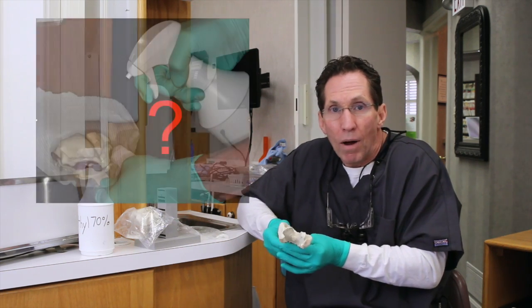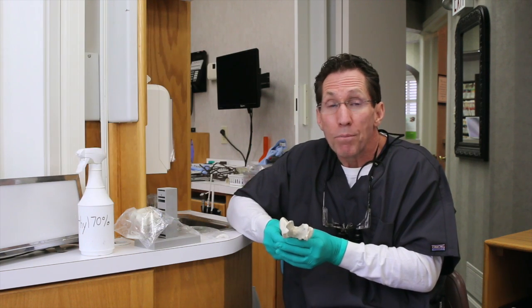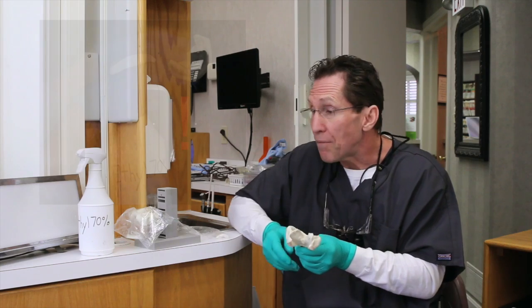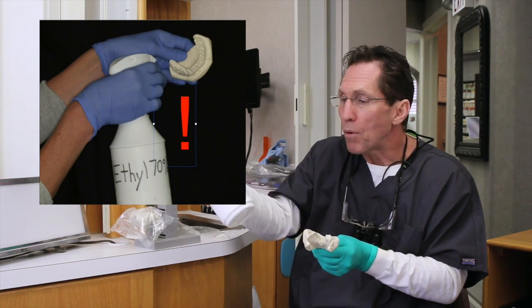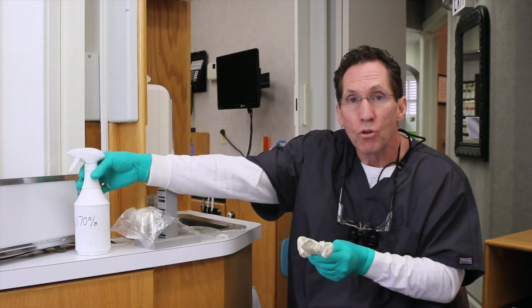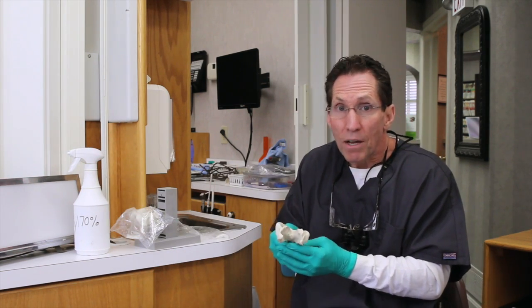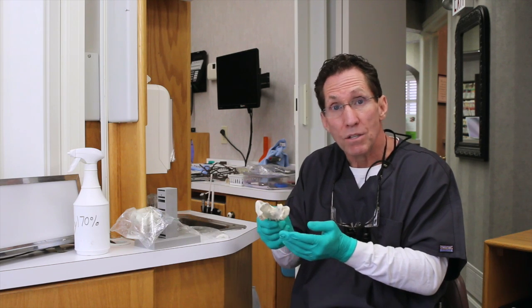And so what do we do? Well, I personally, and this is a personal decision for you, I do not disinfect my impressions. I do disinfect the cast after the impressions are poured, and I will use a 70% ethyl alcohol containing disinfectant. But I personally do not disinfect the actual impression itself. Again, for you, it's a personal decision, and certainly if you don't disinfect, the impression needs to be handled appropriately through the process of pouring.